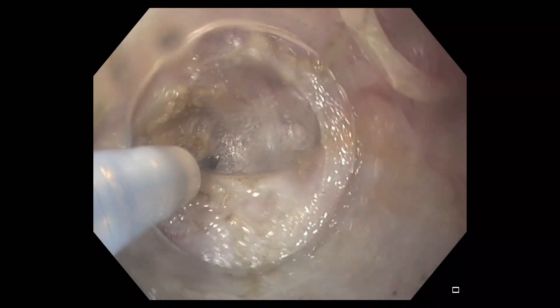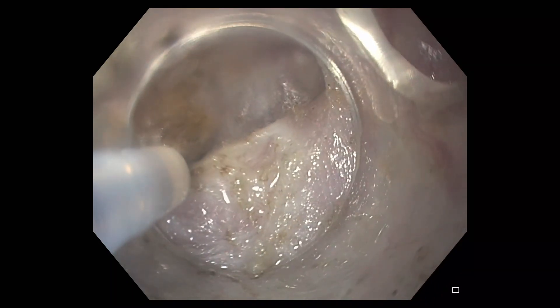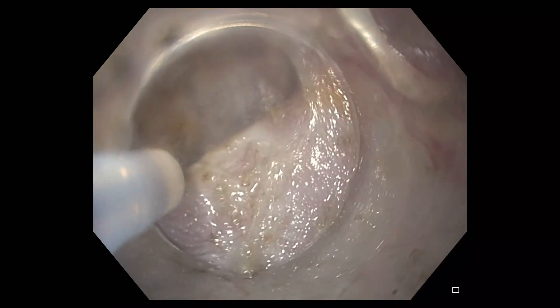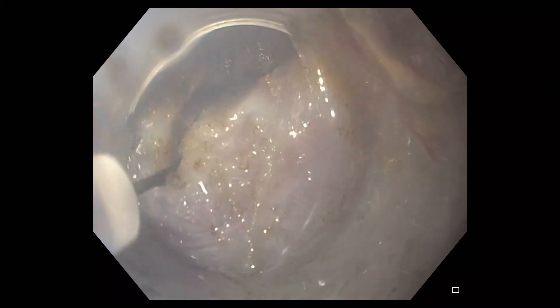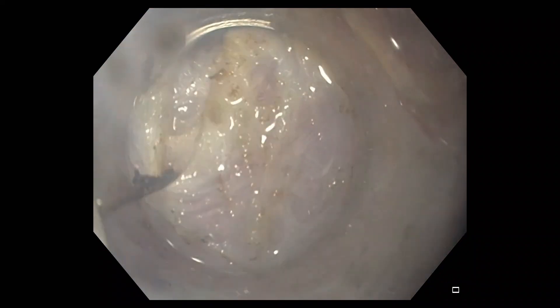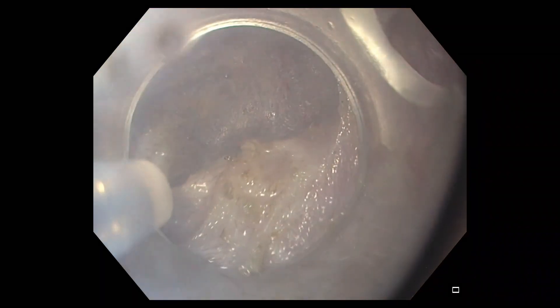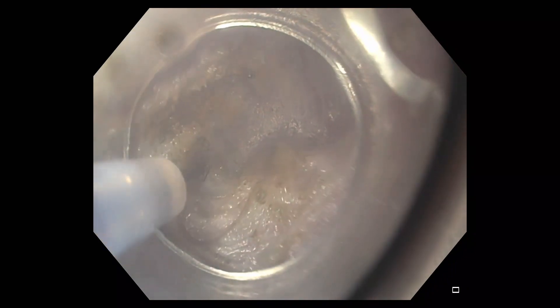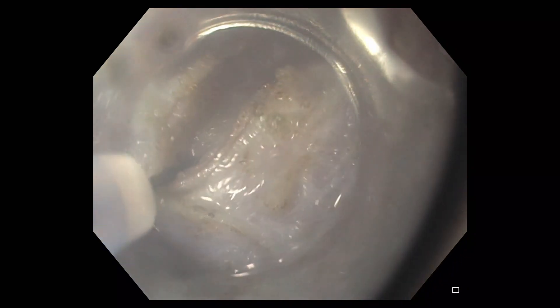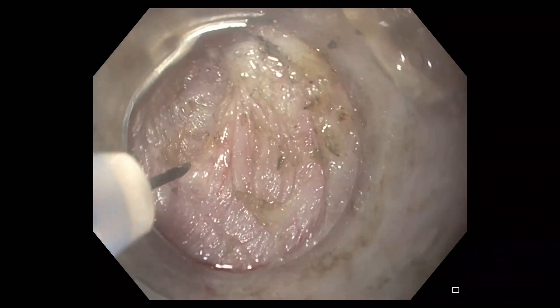The triangle tip of the knife is then used to grab the pyloric ring. Using gentle retraction and a combination of cutting and coagulation current, the muscles of the pylorus and the distal antrum are sequentially divided. Retraction of the triangle tip J during the myotomy portion of the procedure allows for controlled division of muscle fibers while minimizing the risk for perforation into the peritoneum.